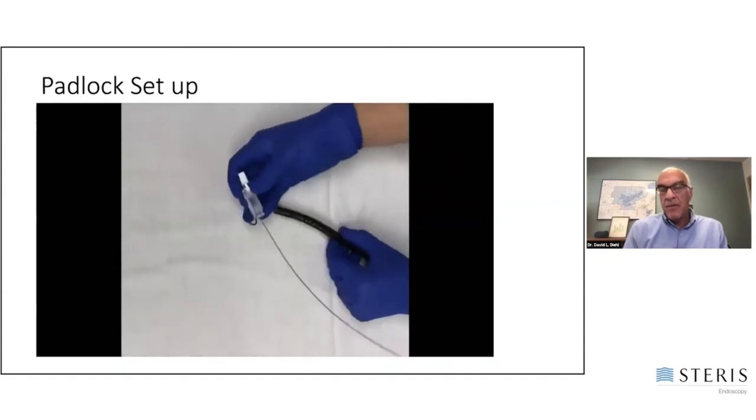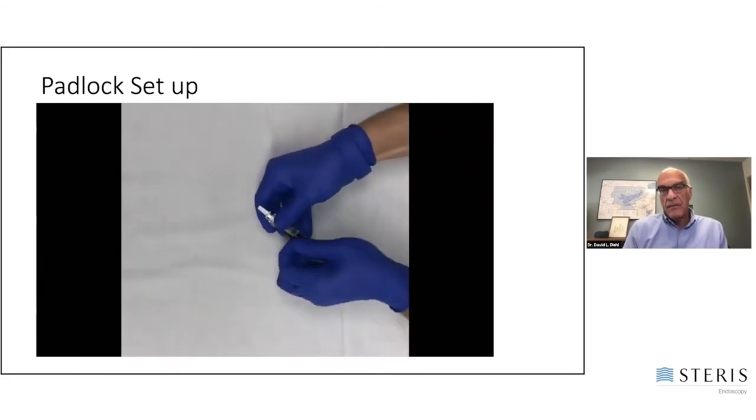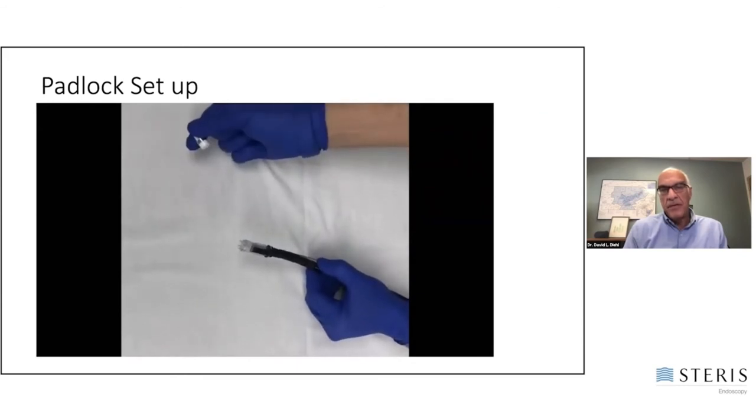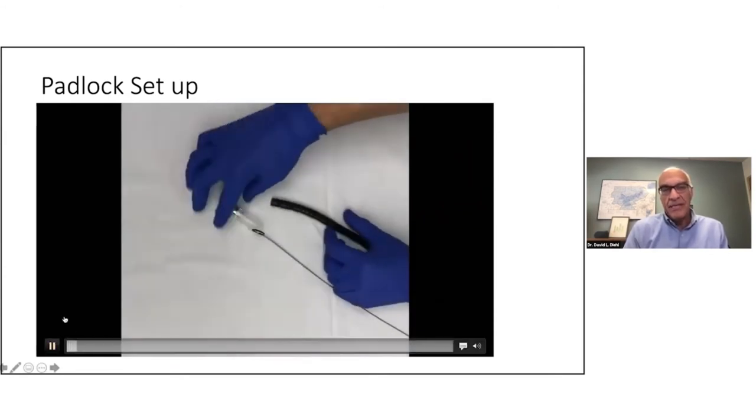The thing I really like about it is that setup is extremely easy. It's just a matter of putting it on, putting this rubber band on, and then pulling the cap off, and it's ready to go. In fact, that was 12 seconds. I'm going to play it again because it's so nice and easy to set up.